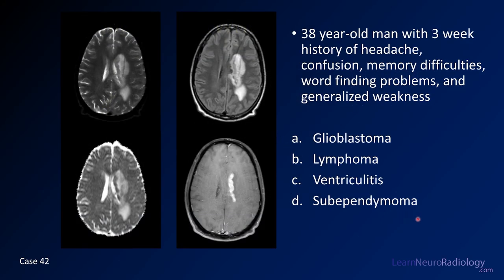Case number 42 is a 38-year-old man with a three-week history of headache, confusion, memory difficulties, and some other generalized neurologic symptoms. We have a T2, a FLAIR, an ADC map, and a post-contrast image. Your choices are glioblastoma, lymphoma, ventriculitis, or subependymoma.